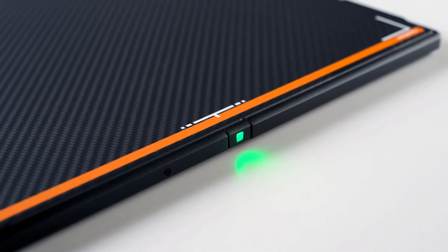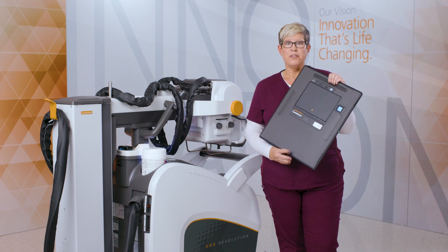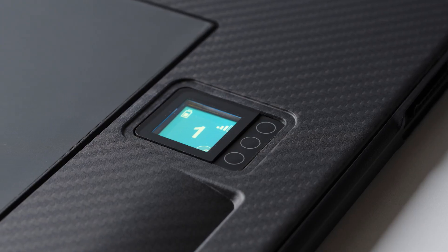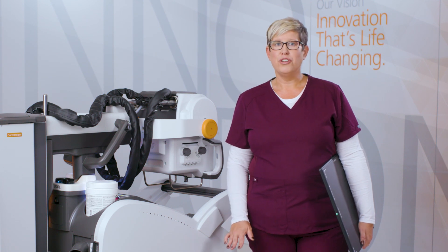Functional lighting provides the operator with visible feedback on the status of the detector. The integrated display provides vital detector information such as Wi-Fi signal strength and battery level. Like the DRX+, Luxe offers a battery hot swap, allowing the user to replace the battery with no detector downtime.